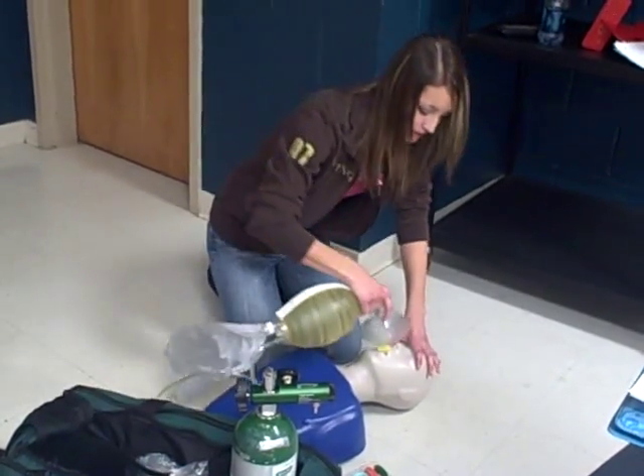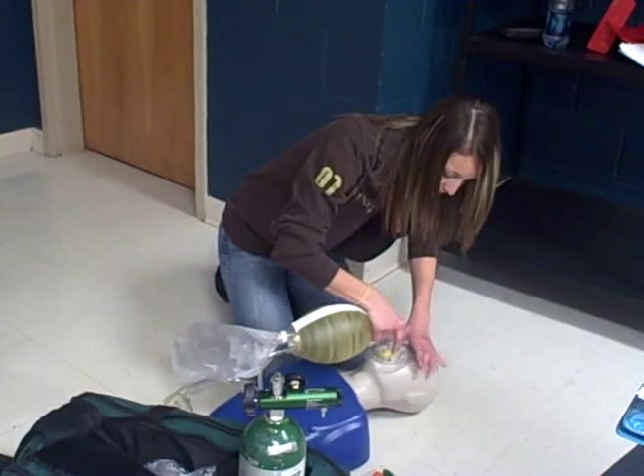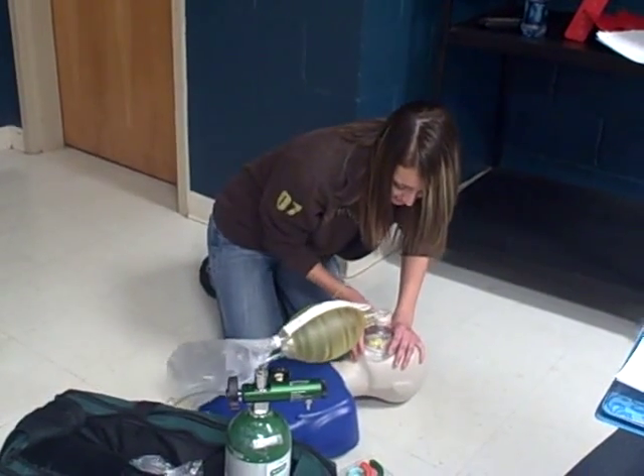Here's the bag mask. Make sure it has a proper fit — it does. Proper seal, face to mask seal.